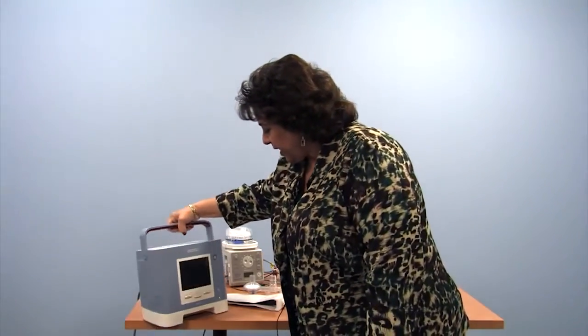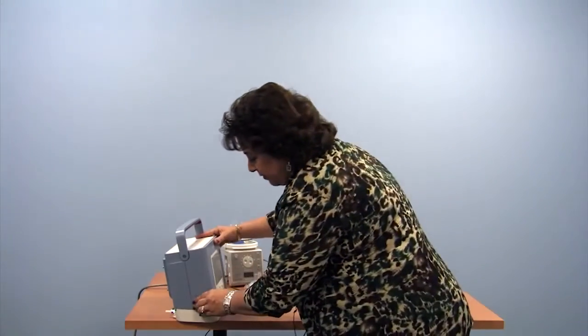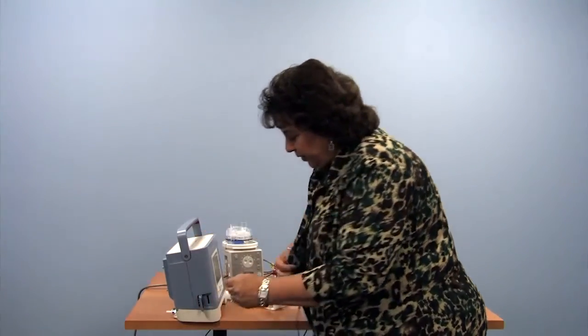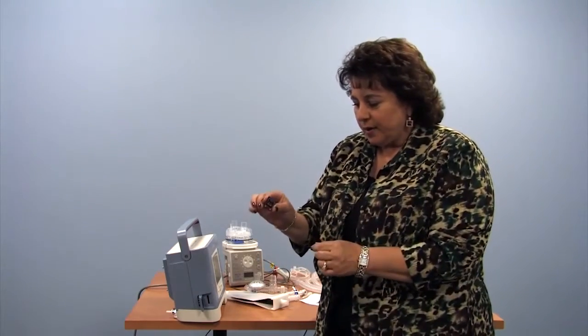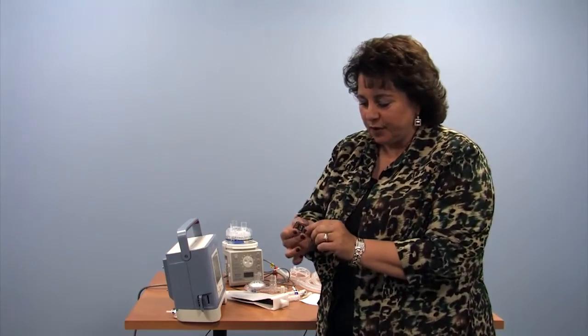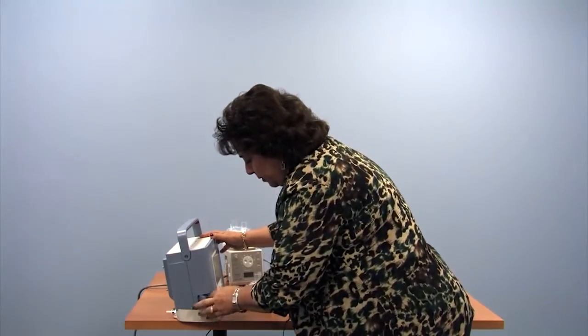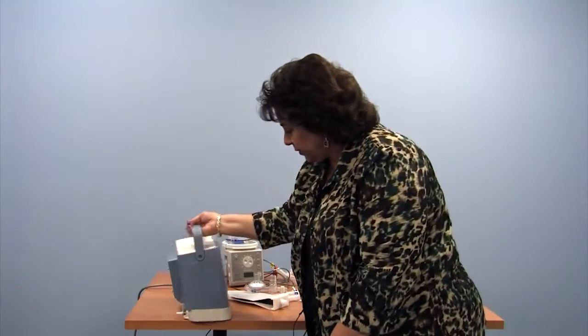Let's turn the machine around. On the front left side, we have a place where, for those of you that are familiar with BiPAP technology, there's a smart card. So the home care company or durable medical equipment company that provides this for you can see if you're using the device. So it's important that they see that it's logging hours. This will not provide clinical information for you about your children.